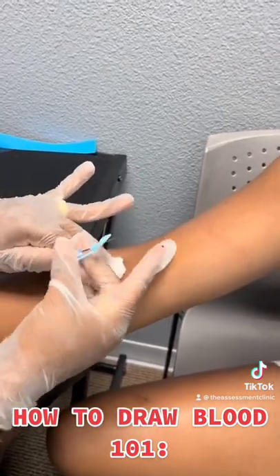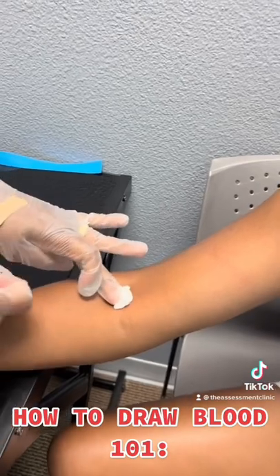Be very careful not to poke yourself. Recap the needle and apply a band-aid.